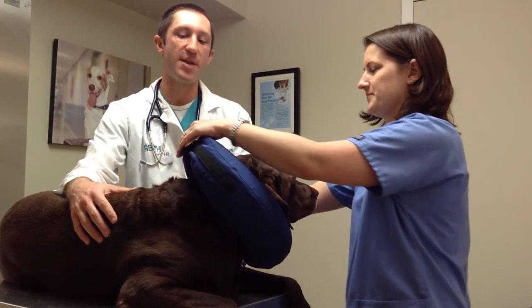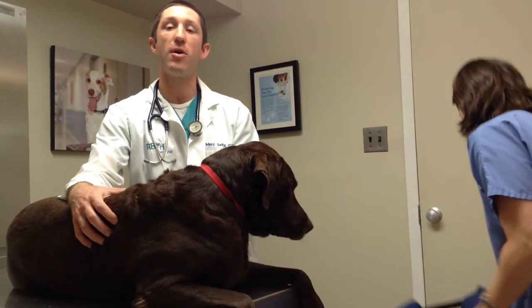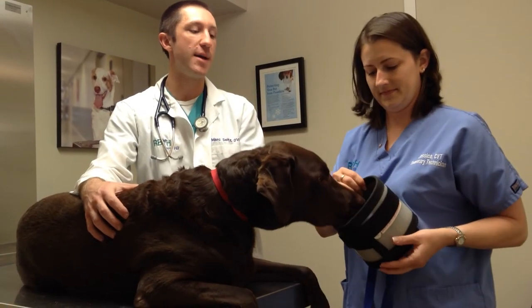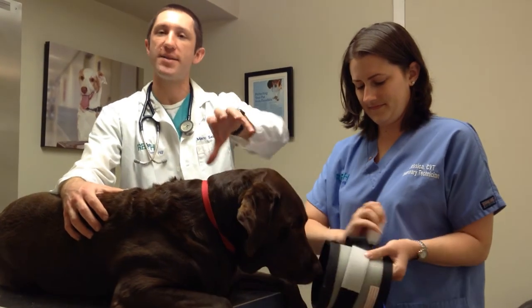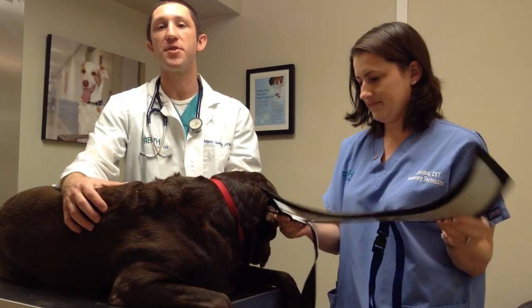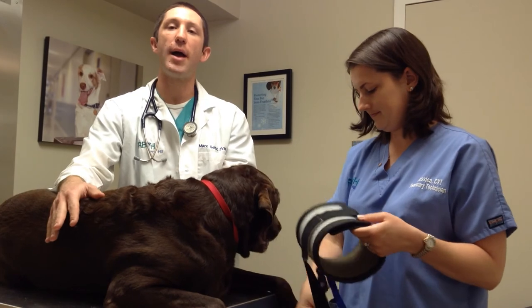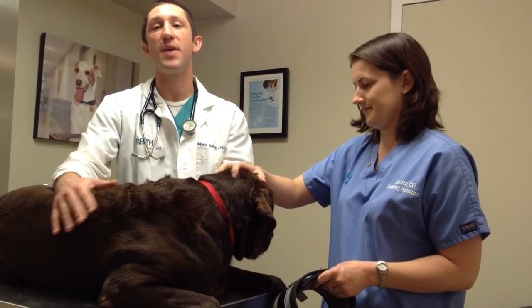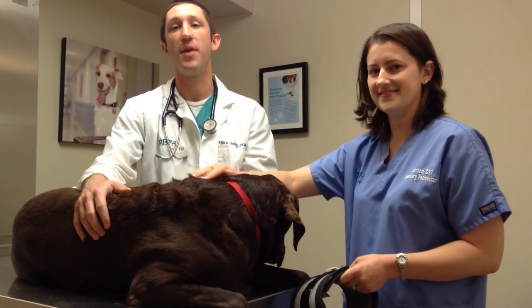The final type we'll be discussing — we actually don't have Sedona's size, so we won't be able to put it on her, but it's the same principle. It's called a bite knot collar, and basically it looks like a neck brace — a plastic sheath designed to wrap around the neck. When fitted properly, it prevents the neck from moving and touching various parts of the body. So there you have it — those are the four main types. Although there are lots of manufacturers, you should be able to apply almost any type you can find by looking at those four main types. If you have any questions or concerns, please consult your local veterinary professional. Thank you so much.